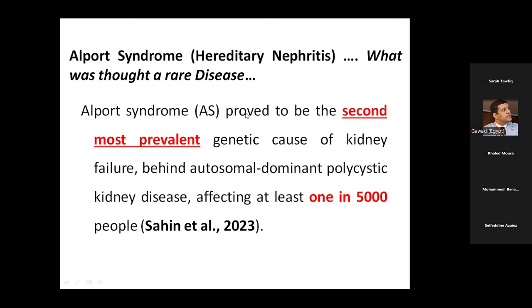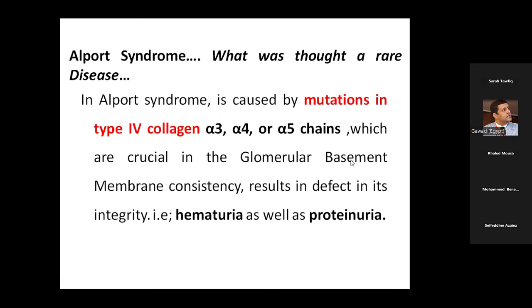Yes, very clear. The point you mentioned now is very important. And I think when you talk about Alport syndrome, you will say that it is much more diagnosed now than in the past. And thin membrane disease now is separate from Alport syndrome; we have nowadays a separate disease called thin membrane disease.